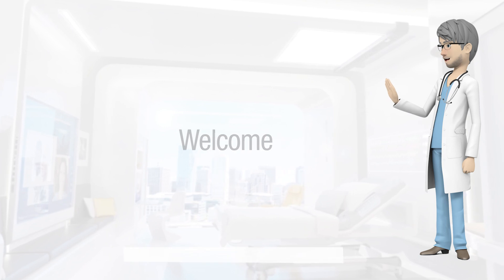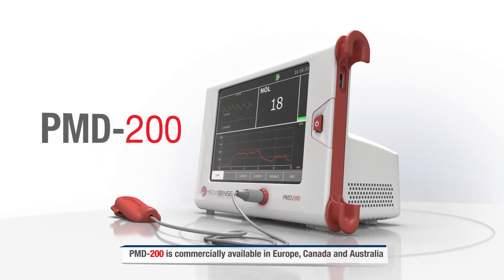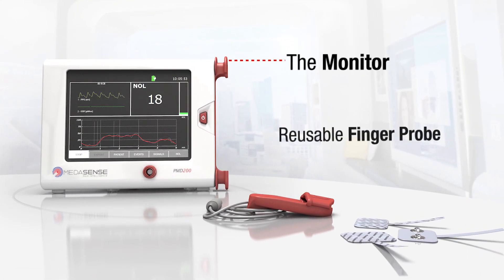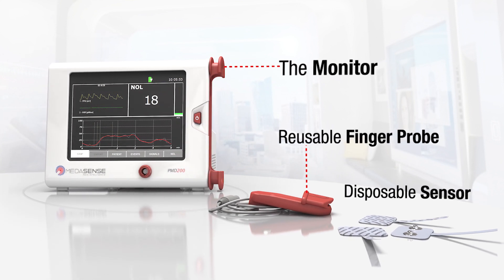Welcome. This tutorial will show you how to operate the PMD200 system. The PMD200 system includes three main components: the monitor, a reusable finger probe, and a disposable sensor.